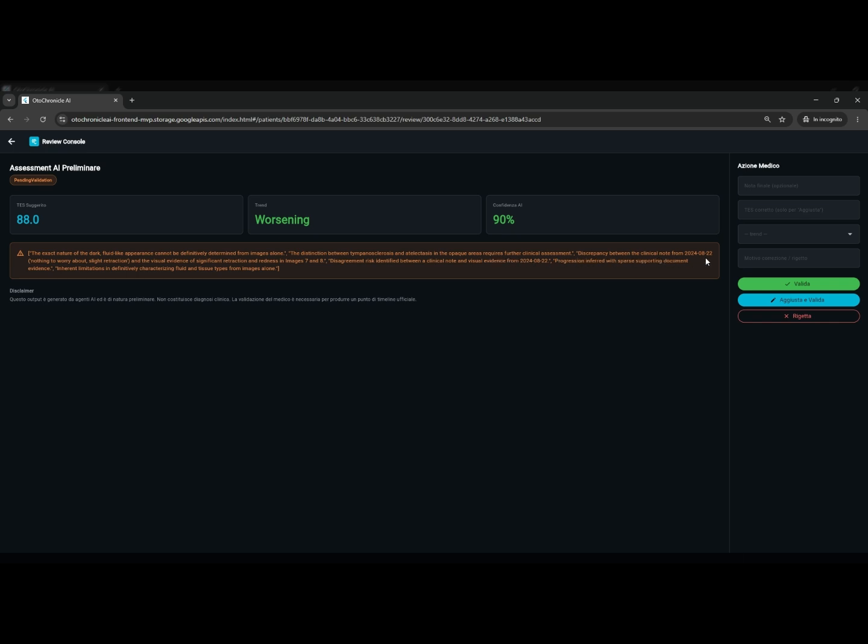Let me be crystal clear here. OtoChronicle AI does not replace the physician. It amplifies them. Every AI output is preliminary. The physician can validate, modify, reject, or annotate it. And the system preserves everything: the original AI output, the physician's correction, the full history of disagreements. This builds a complete clinical audit trail, and, over time, a human-validated ground truth dataset.